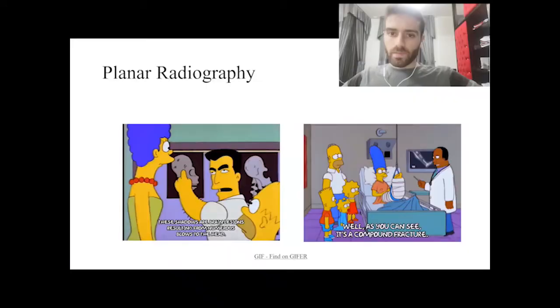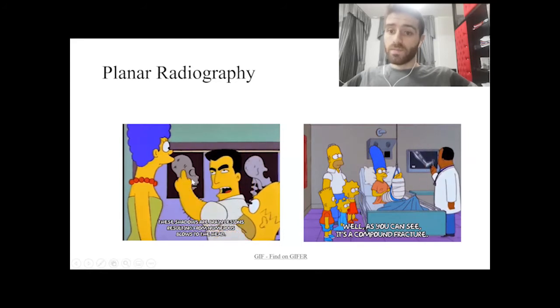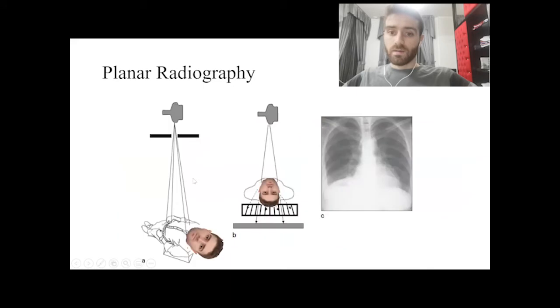Stay tuned. X-ray planar radiography provides a screening for acute injuries like a bone fracture and suspected chronic diseases, for example in the case of cancer. A reminder, the basis of planar radiography is the differential absorption and scattering of X-rays within the tissues of the patient. The X-ray beam from the tube is collimated, passes through the patient, and forms an image on the digital detector placed below the patient.